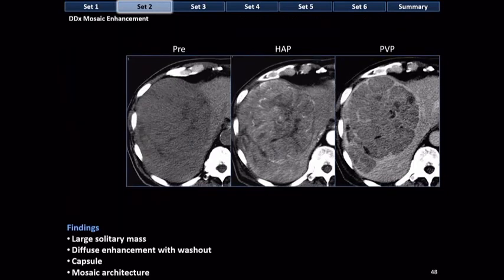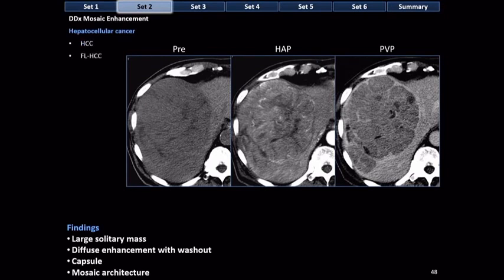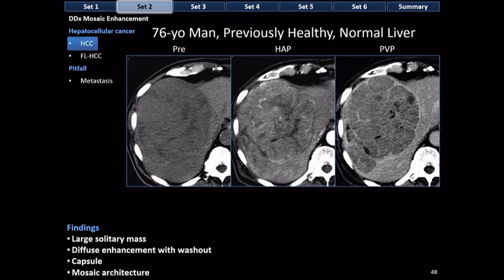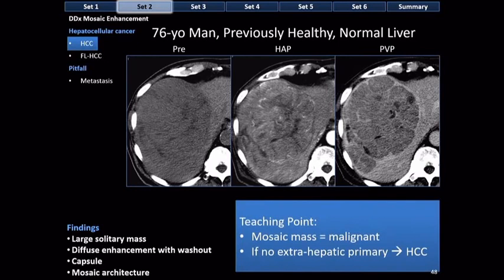The differential diagnosis for mosaic enhancement is very short: hepatocellular carcinoma — either HCC or fibrolamellar HCC — or a conglomerate metastasis. That's it. If you have a mosaic mass in your liver, your choices are HCC, fibrolamellar HCC, or metastasis. In this case, HCC is most likely because the patient is elderly and previously healthy with no cancer outside the liver. Teaching point: mosaic masses are malignant. If there's no extrahepatic primary, think HCC.